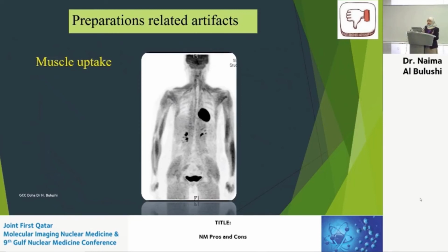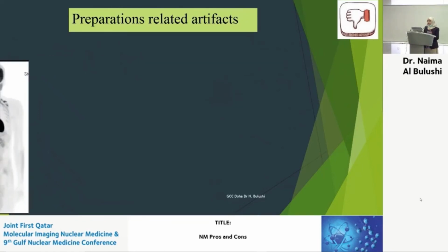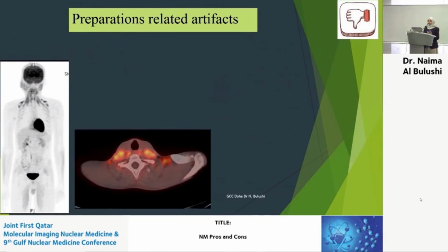So this is again a challenge, and we do have this challenge because we have a high population of diabetic patients, and I'm sure you have them here as well. Brown fat uptake, with the presence of the PET with the CT, it's not an issue, but again, look at the imaging alone, there is an uptake in the brown fat. There are certain preparations that you can do to reduce the brown fat uptake.